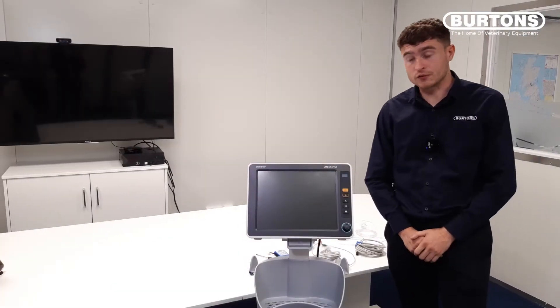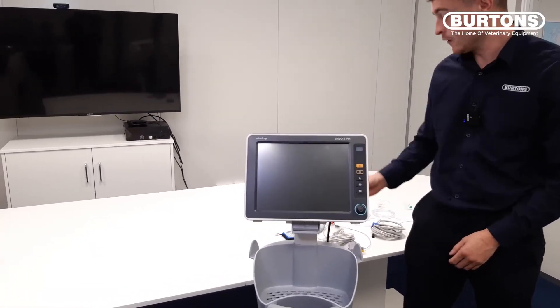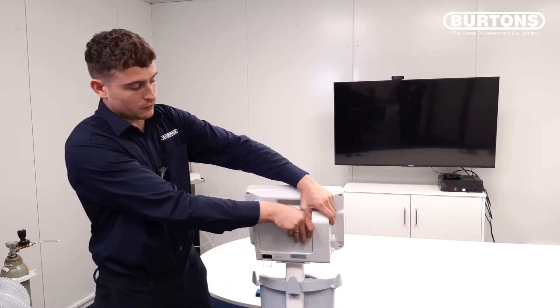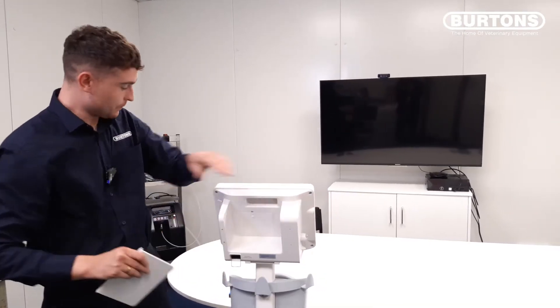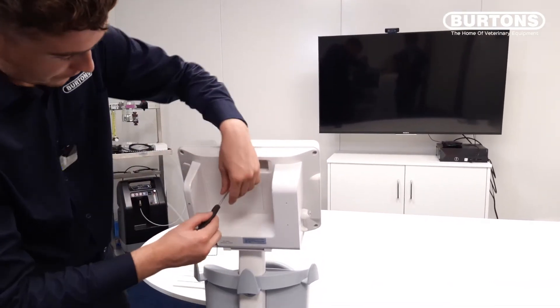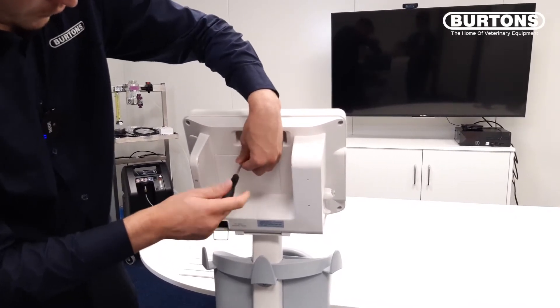As part of this demonstration I would like to show you how to install the battery, and to do this you will require a small Phillips screwdriver. Once we have the monitor turned round, we need to remove this flap and we take our Phillips screwdriver and we just undo the screw.